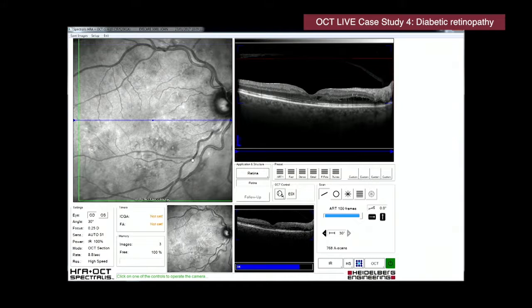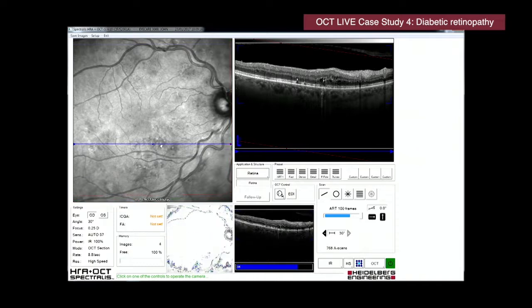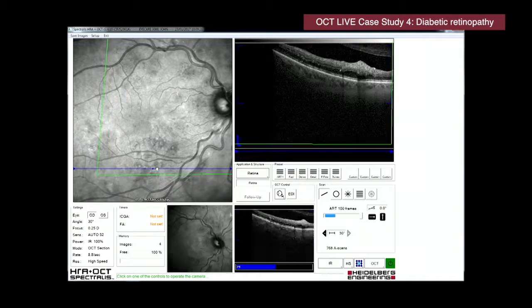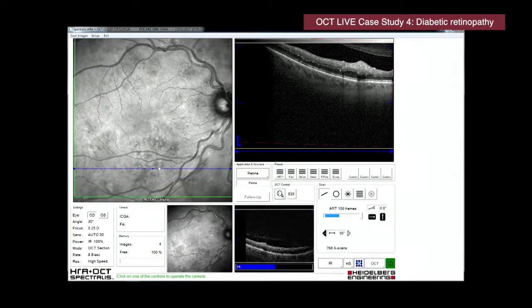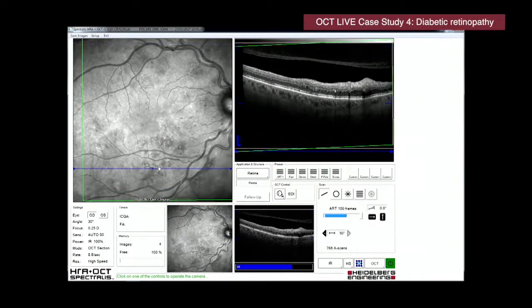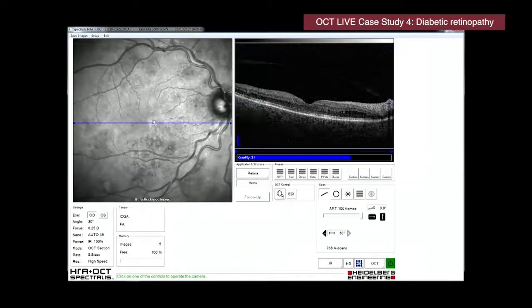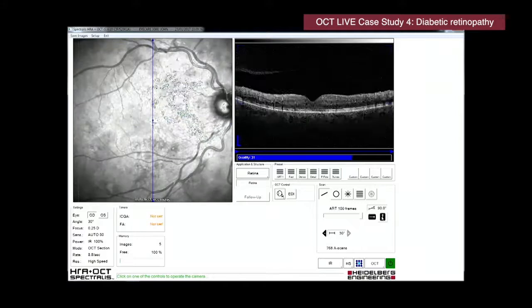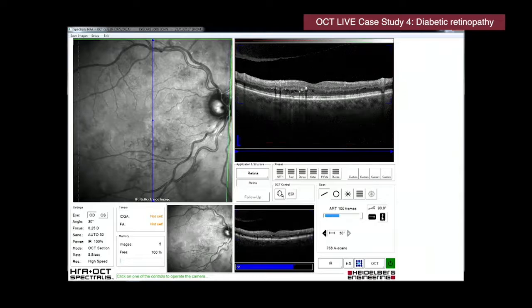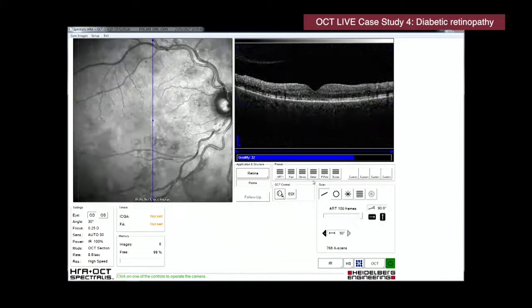So Phil, if we look at these changes inferior to the macula, just click here. And again, we can just acquire an image there. Let's move down to this spot just here, a bit further down. So exactly wherever you're seeing the changes, you can simply drop an OCT cut through. So you don't need to be an expert in interpreting the images to see that quite clearly there are some changes here and the changes that need to be documented. Again, a vertical scan. And I'll do a macular volume as well.